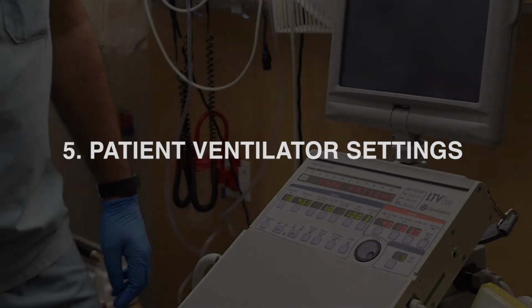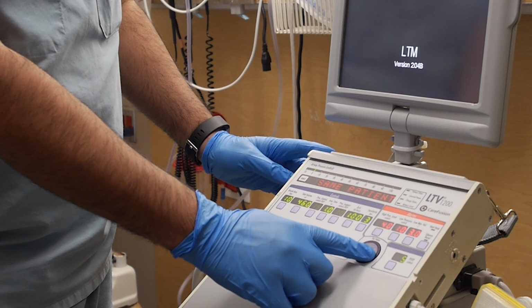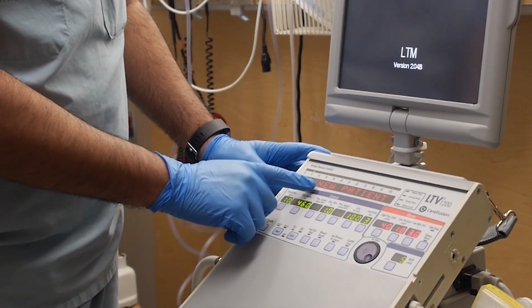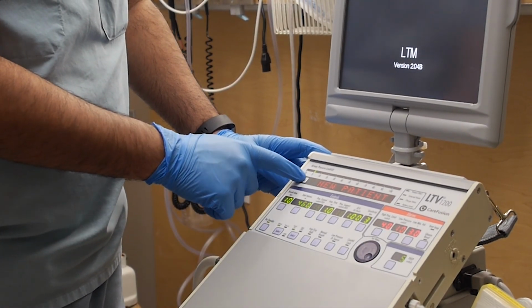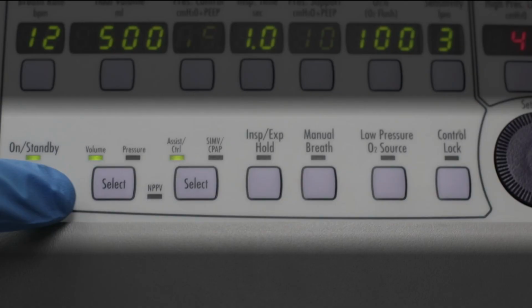Emergency department, respiratory therapy, and ICU leadership have collaborated on simplified initial settings which will work for the majority of COVID-positive patients intubated in our emergency department. Patients will be ventilated using volume assist control. You can choose this setting using the 2 buttons at the bottom of the panel. To change this setting, the button must be pushed twice.